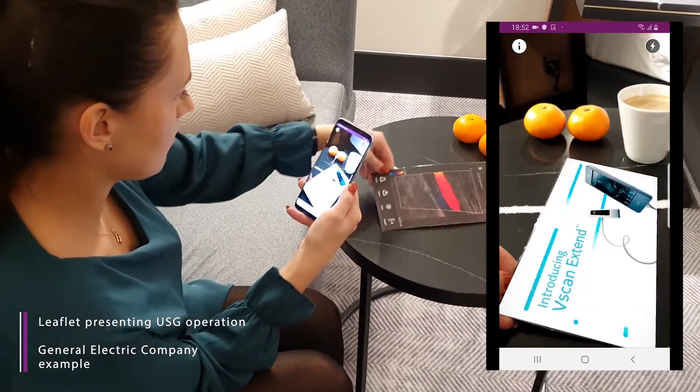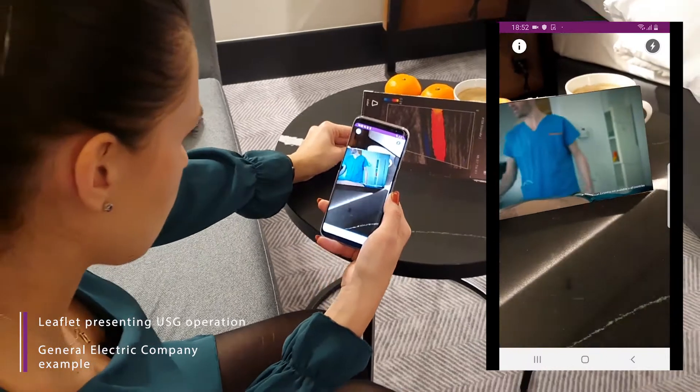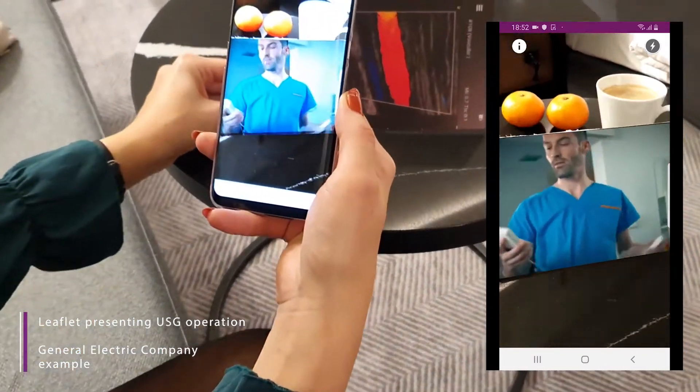Introducing V-Scan Xtend. V-Scan Xtend is designed for speed in clinical encounters. The system starts in less than 10 seconds from standby.